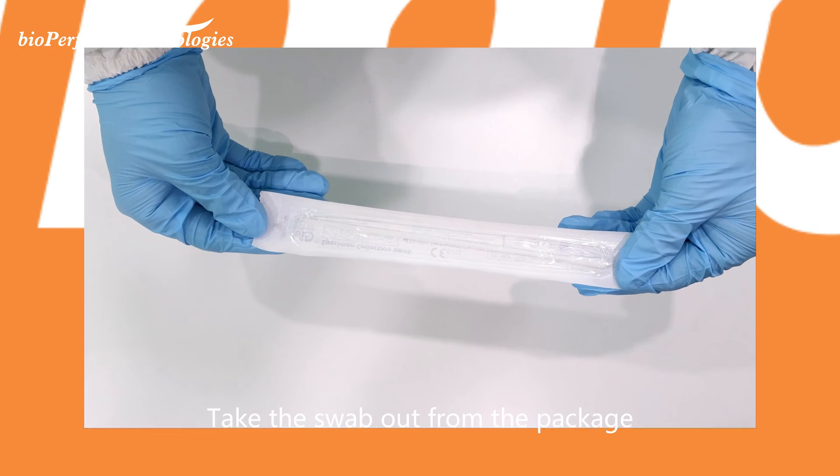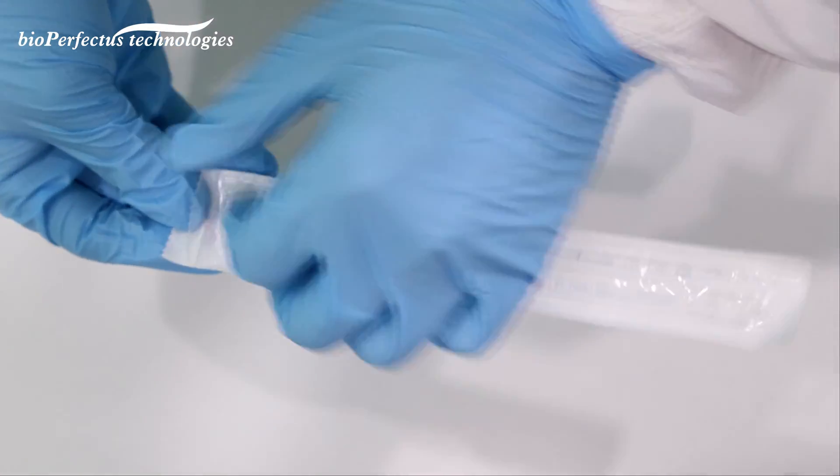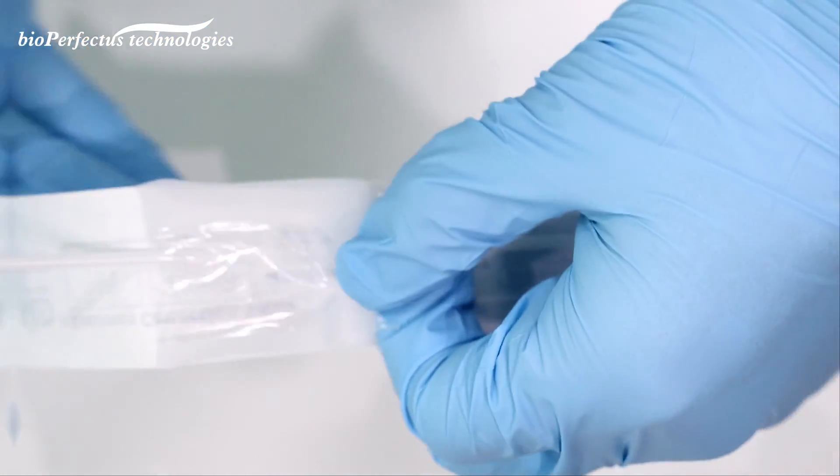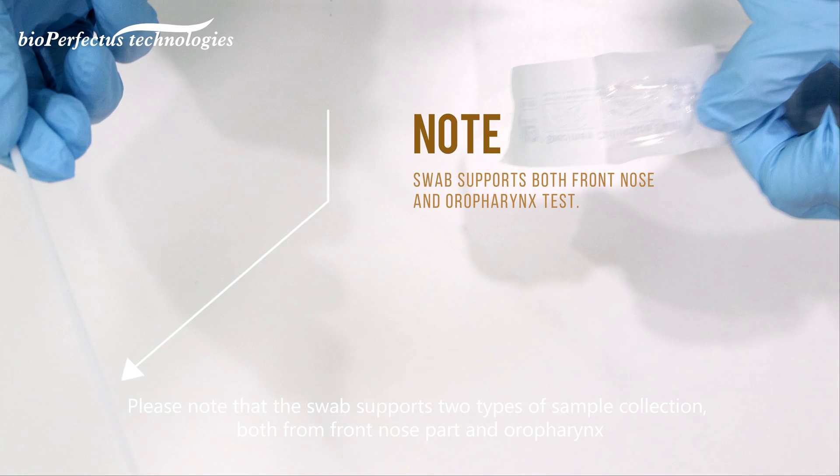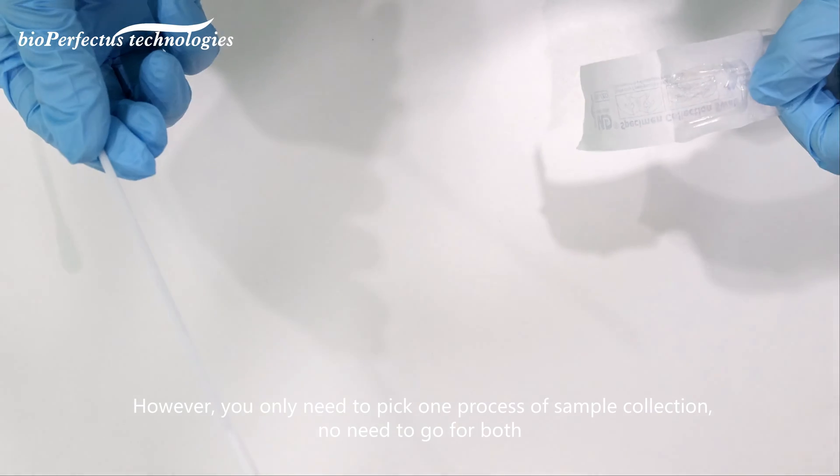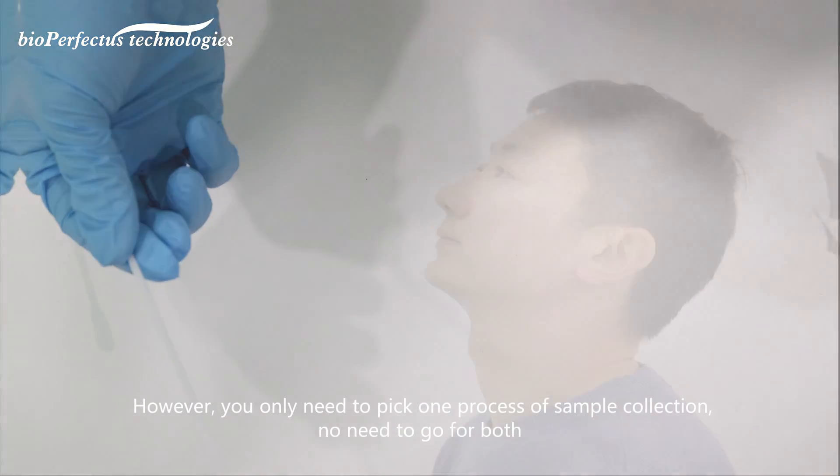Take the swab out from the package. Please note that the swab supports two types of sample collection, both from front nose part and pharynx. However, you only need to pick one process of sample collection, no need to go for both.